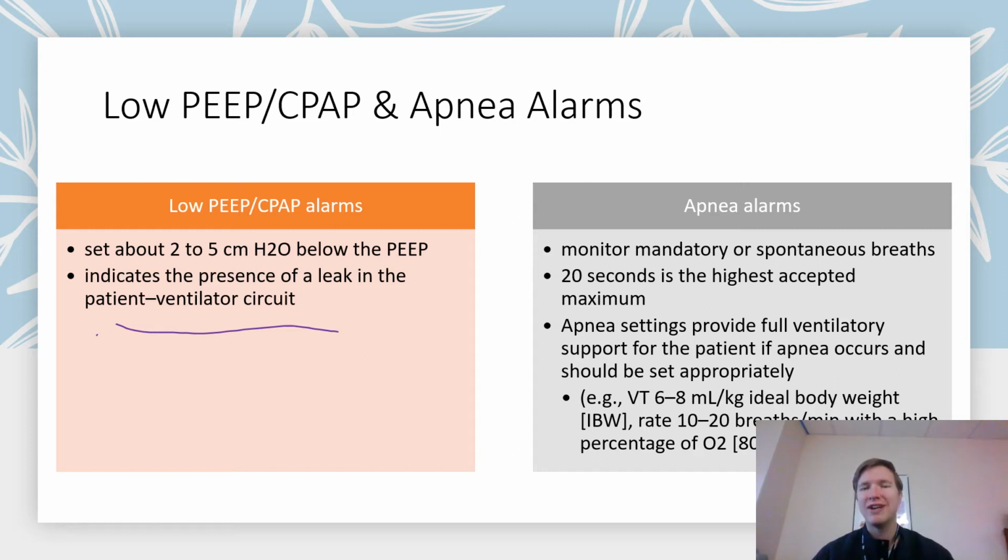Right? So 20 seconds is the highest accepted maximum for allowing that patient to go without breathing. So that's traditionally a time interval that you'll set when you go into the apnea alarm mode.